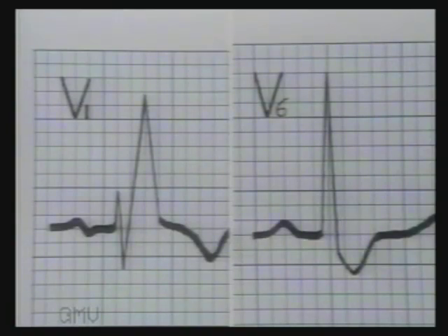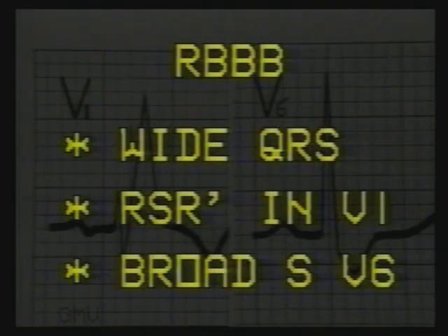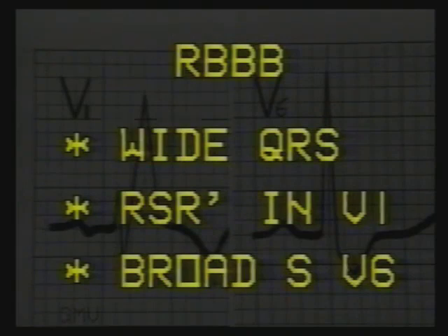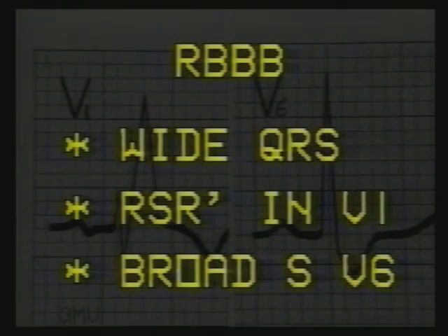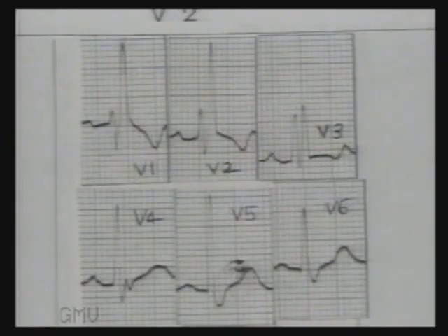To revise: right bundle branch block shows wide QRS complexes 3 mm or more wide, an RSR' pattern in V1, and right axis deviation may be present.